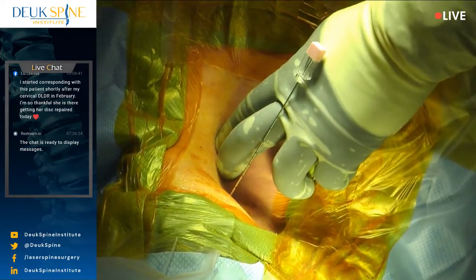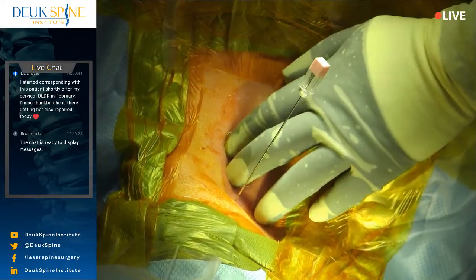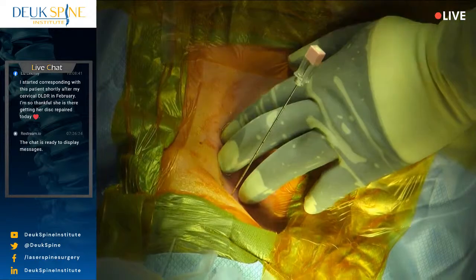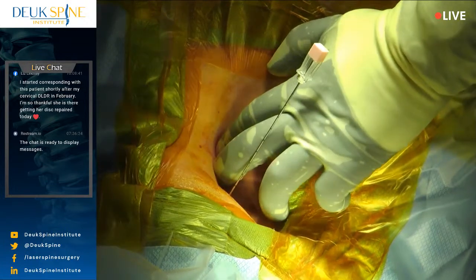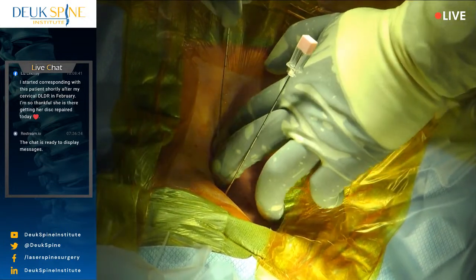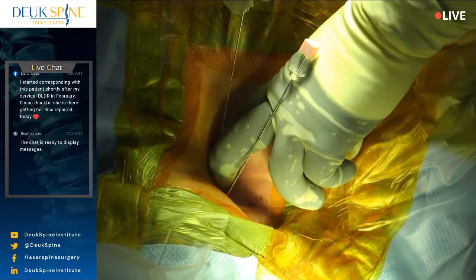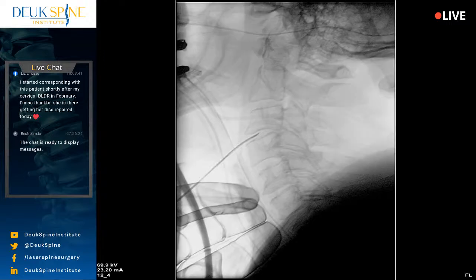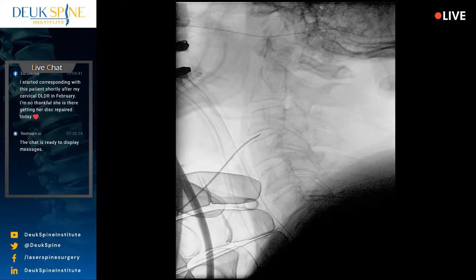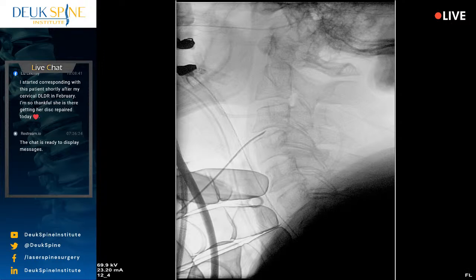Give me a little bit of irrigation here. Helps my fingers slide on the skin a little bit better. Shot, let's just make sure 3-4 is not moving significantly. All right, good. Let's see where we are here. Shot, okay. That's better. And shot again. It's a little too high. Let's see, hold on. Shot. Shot. I need a little more there. I can almost see the gap, Luis. Yes, sir.